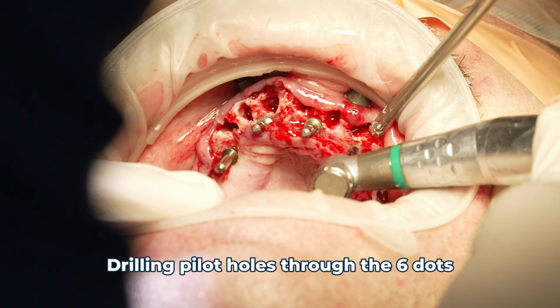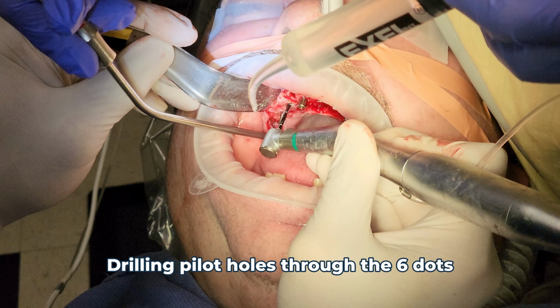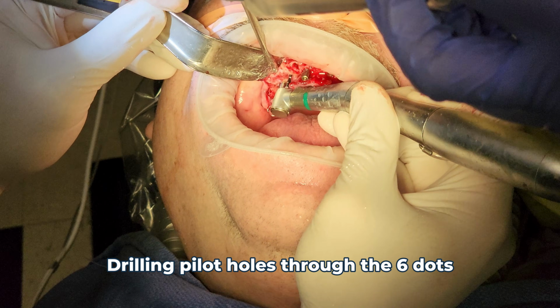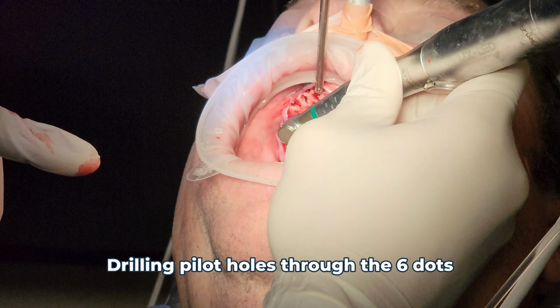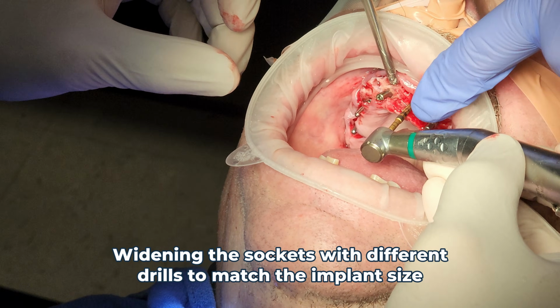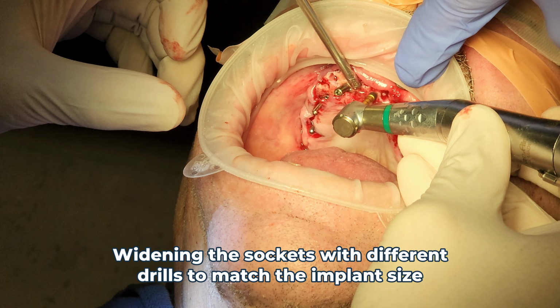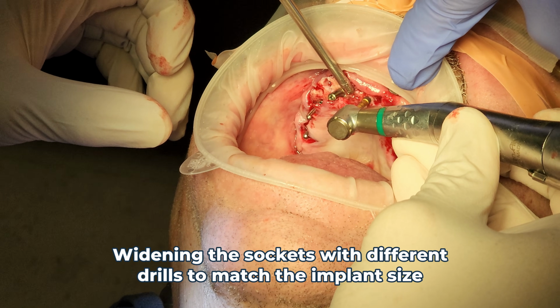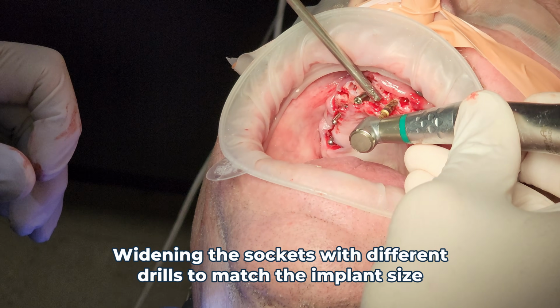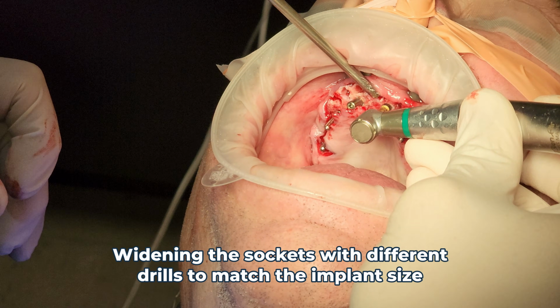Now, after we've made each pilot hole, you'll see we're putting in these little metal markers, and these ensure that we are lining up the implants close to parallel with each other. In turn, this ensures that the final prosthesis will engage with each implant as well. After each pilot hole we have done, we go back in with a series of drills, each one a little bit wider than the previous one. And this will widen each of these sockets to the size of the implant that works best for the local bone thickness in that spot.